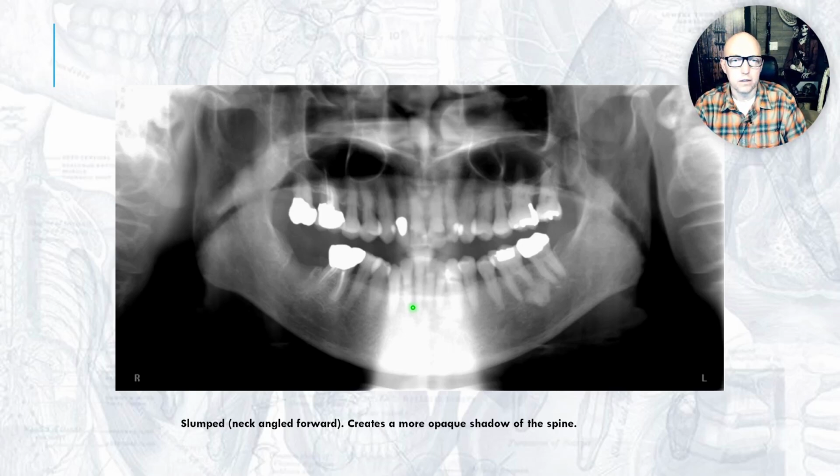All right, so that went on a little long, but hopefully gives you a good review of panoramic imaging and is helpful to your interpretation of panoramic images, because you have to start knowing anatomy, knowing why you're seeing what you're seeing in a panoramic image. And if you can do that, hopefully you can make sense of things. If you see things that you don't recognize, either study it and look at what it is, see if it might be an anatomical structure.